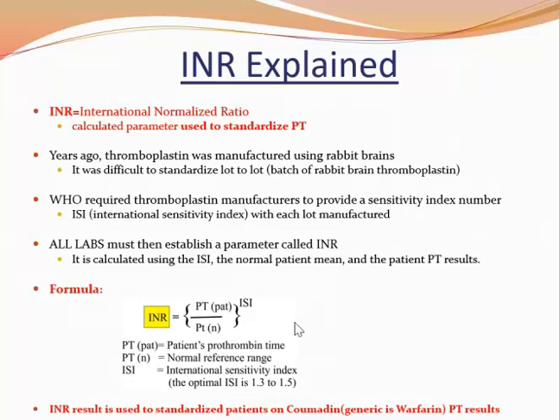Now, you do not have to memorize this formula or know it by heart. I just wanted to show you this formula so you know where we come up with this INR. On our automated analyzers, this formula is plugged in and it usually calculates it for you, so you don't have to calculate this by hand normally. The INR result, again, is used to help standardize results for patients on Coumadin therapy.